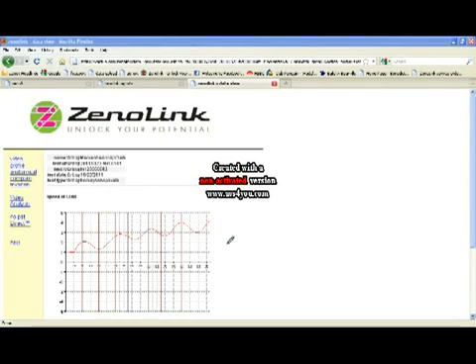What we like to see here is a very distinctive pattern of lull through mid-stance, acceleration through toe off. We see the pattern. Pattern's pretty effective.